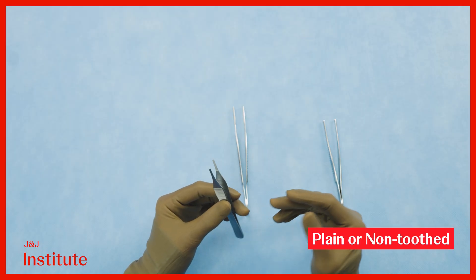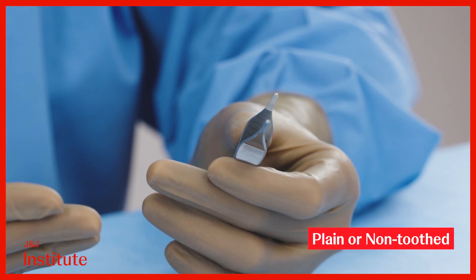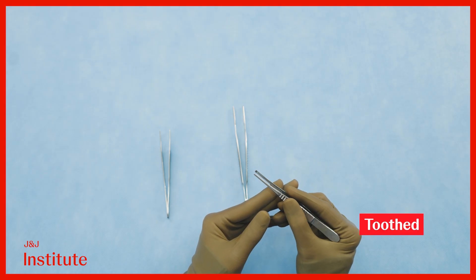Non-toothed forceps are typically reserved for delicate soft tissues like the liver, spleen, bowel, kidneys, and ureter. Therefore, toothed forceps are actually more commonly used at surgery overall.